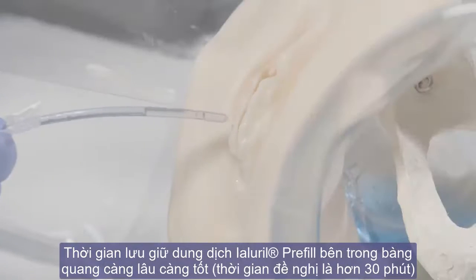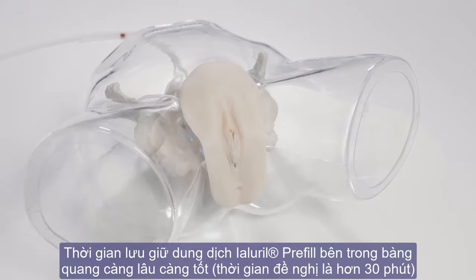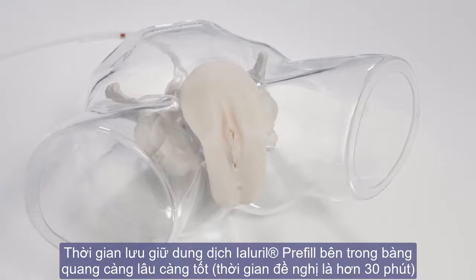Now the installation procedure is finished.